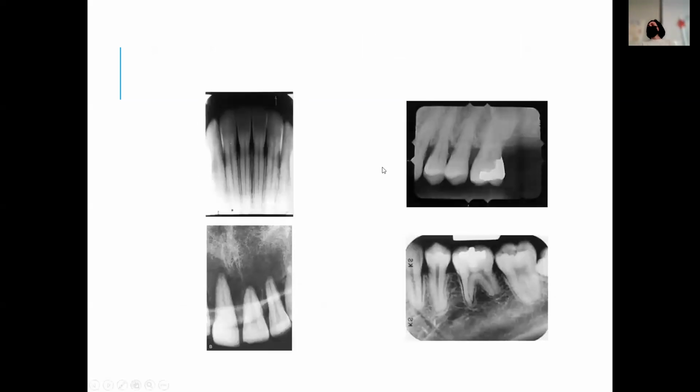What about this up here? That's obvious, right? You're like, that looks very stretched out. The roots even go off the edge. It's just totally stretched. So that sticks out a lot more.